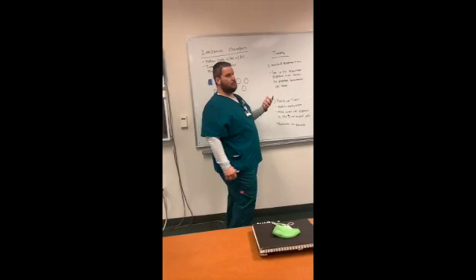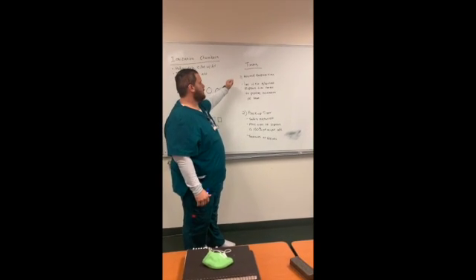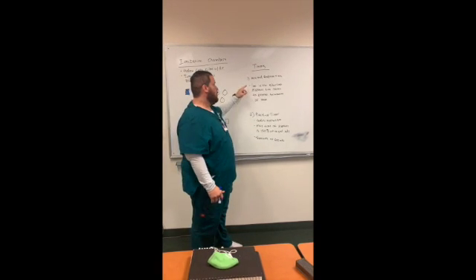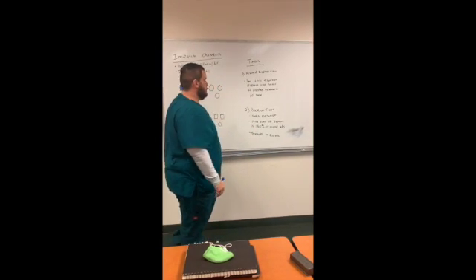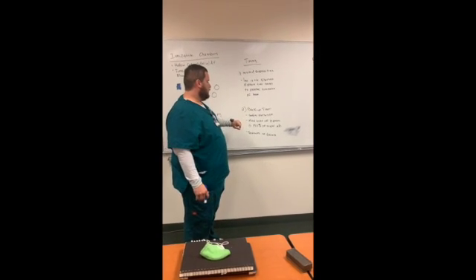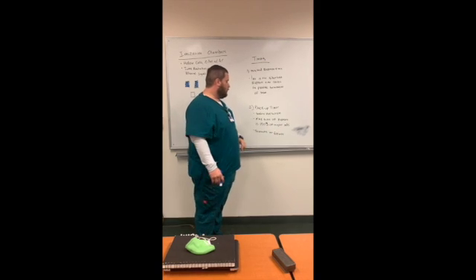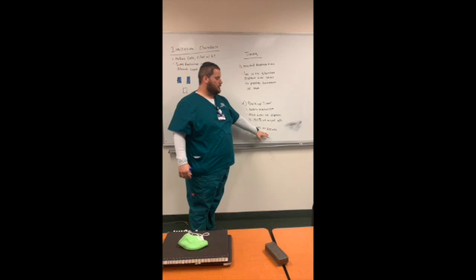Now, for the timing, the minimal response time, the shortest exposure time needed to produce termination of the X-ray beam, is 1 millisecond. Now going into the backup timer, it's a safety mechanism that has a max exposure time of 150% of the original mAs, and it terminates when it reaches 600 mAs.